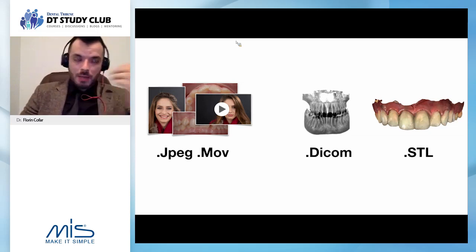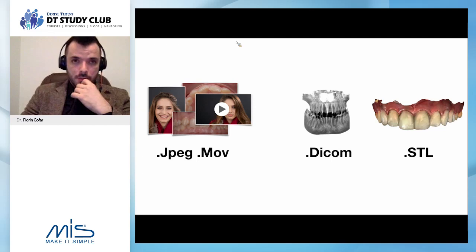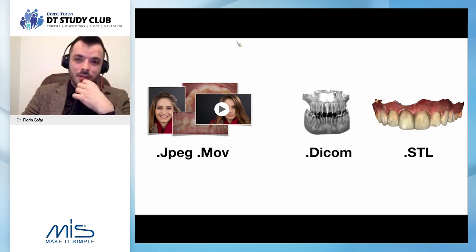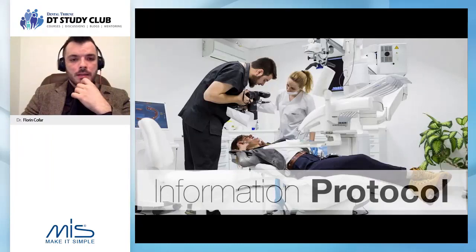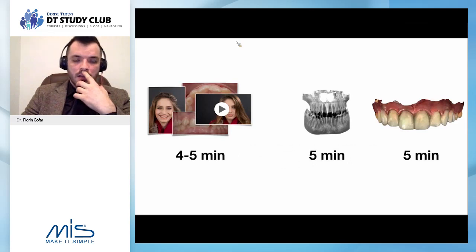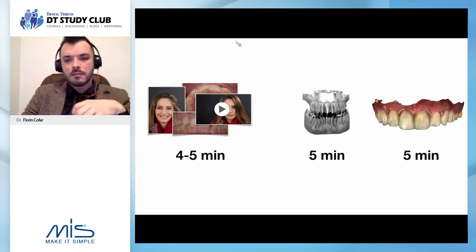And why does it replace the classic consultation? Well, simply because if you have this, you no longer need to spend time looking inside one's mouth, because when you actually plan, even in the past, you would always plan on the records, right? So the thing is, time is important, and this is basically a simple information protocol that time-wise is actually very fast. This is the input that we need in digital dentistry, and it's a universal input.